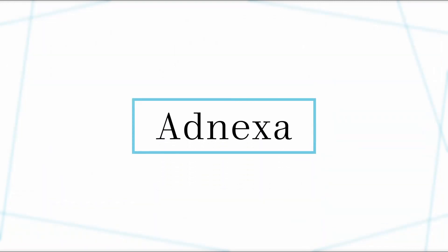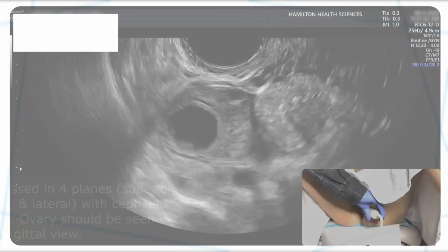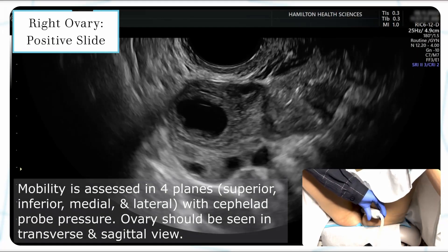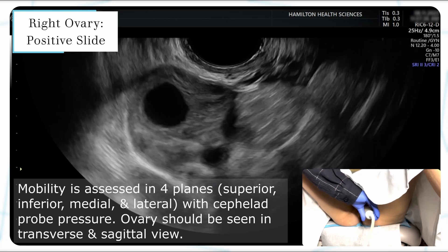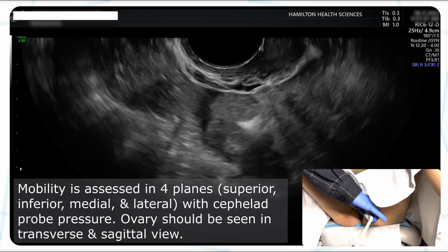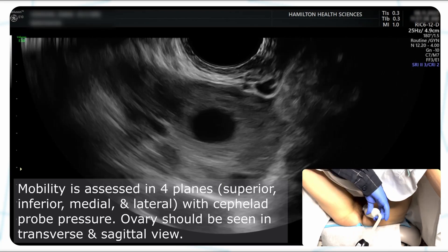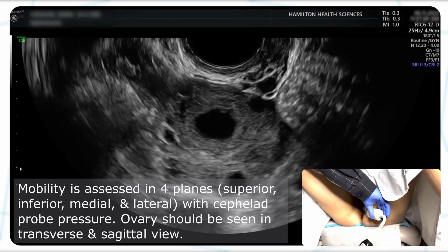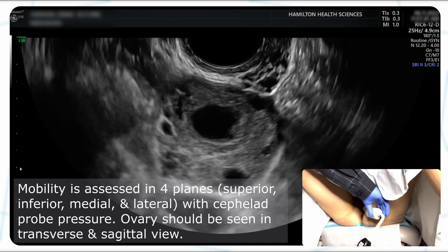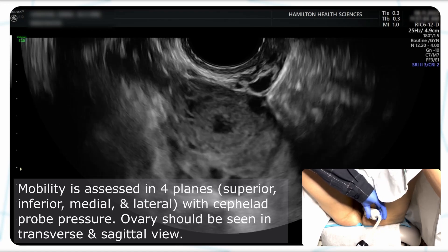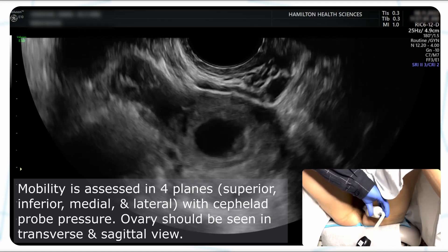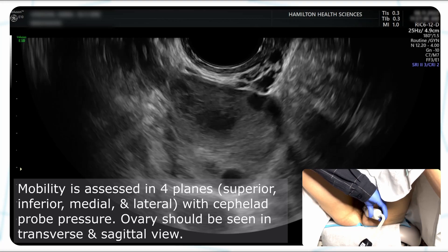In this segment, the adnexa will be assessed for mobility. Pushing on the ovary, we see lateral mobility and medial mobility. Going into sagittal orientation with the probe, we see the mobility superiorly and inferiorly. This is an entirely mobile ovary.